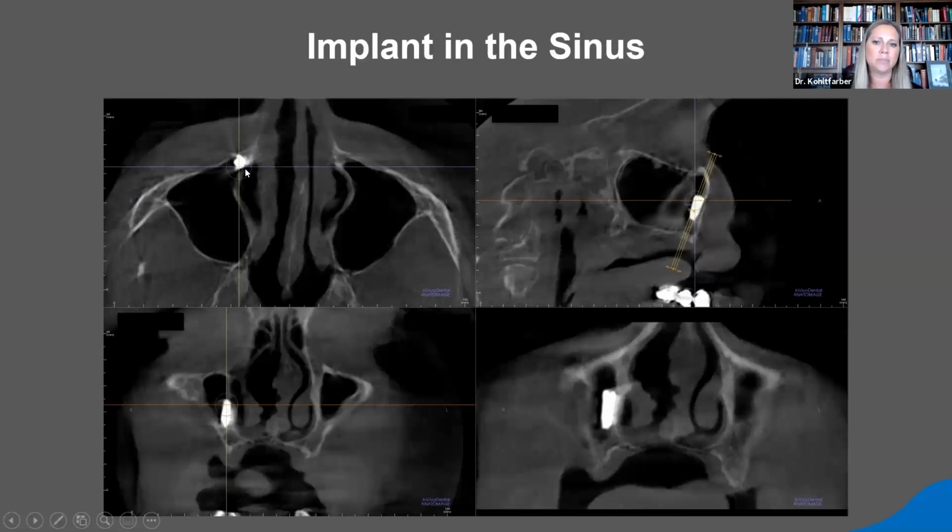This patient came in. The chief complaint was that they had had a history of a failed implant. So they were new to this particular office, took the CBCT, and guess what? We found it. So it is anteromedial to the sinus. It is actually osseointegrated with the lateral cortical border of the nasal fossa. We know the majority will osseointegrate. They integrate wherever they are at. And so this is kind of going to live out its life there. So, you know, I'm sure these guys took the nasal fossa implant course.